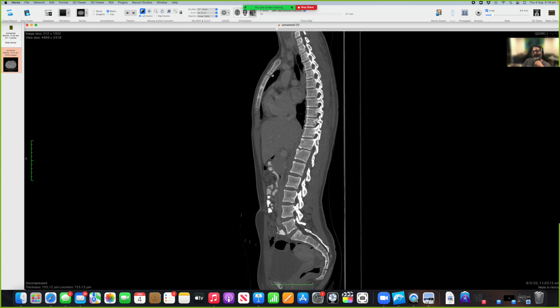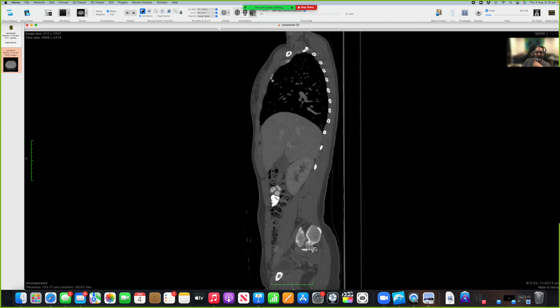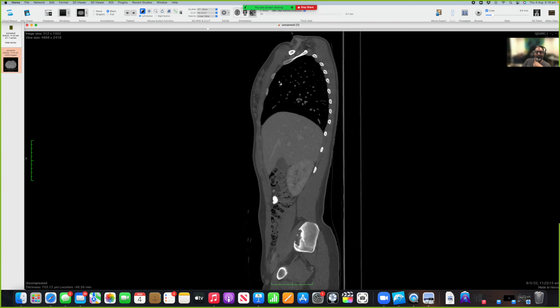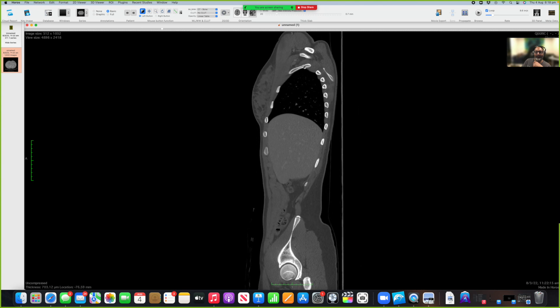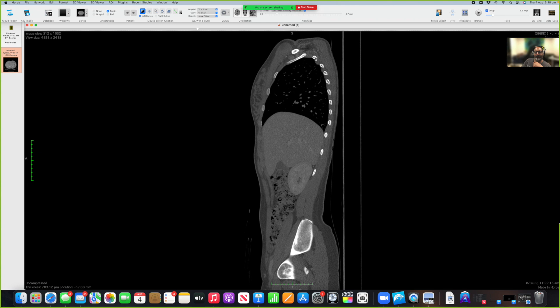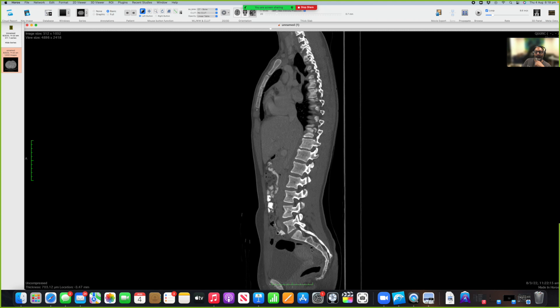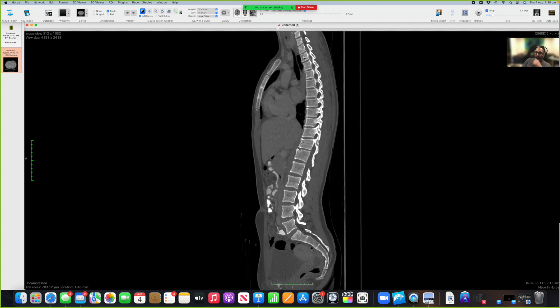What rib attaches to the sternal angle? It is the second rib. So that should be the second rib - if you keep following the second rib, you can see the first rib above it. Keep following the second rib, and you'll find the costal transverse joint because that's the transverse process there. Keep going through and it will join the body at the other end.